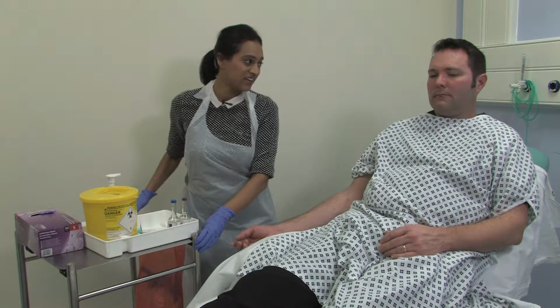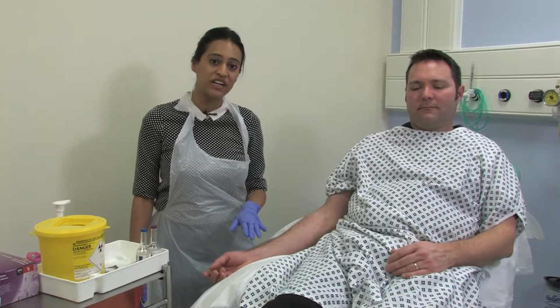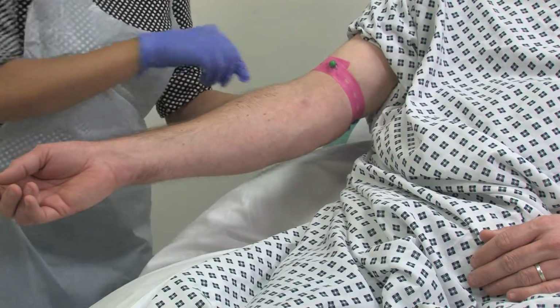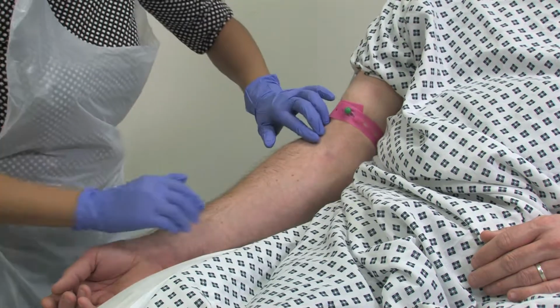So Ralph will be acting as our patient. He has already kindly agreed and consented to have his blood cultures taken today. We can apply our tourniquet and try and identify a vein.